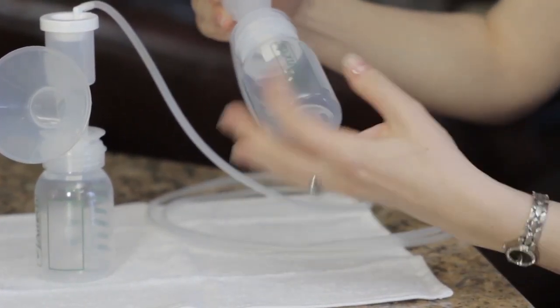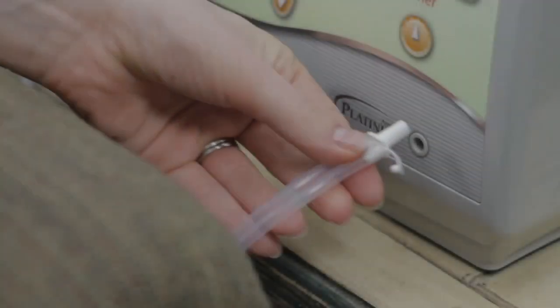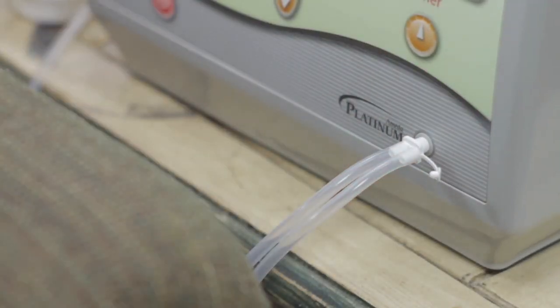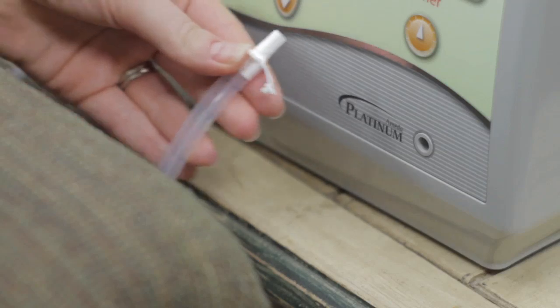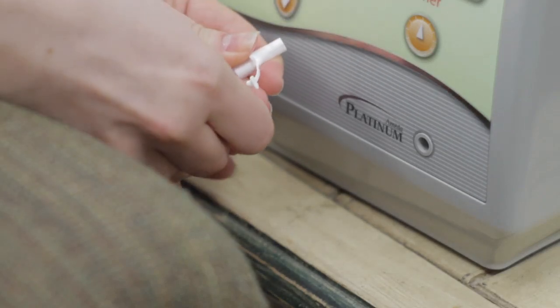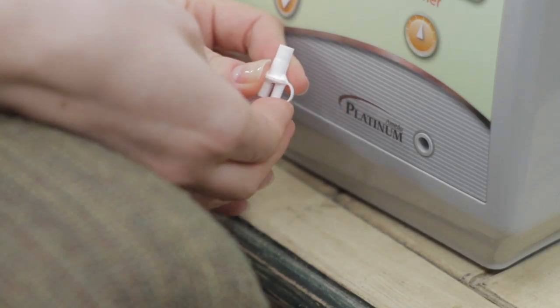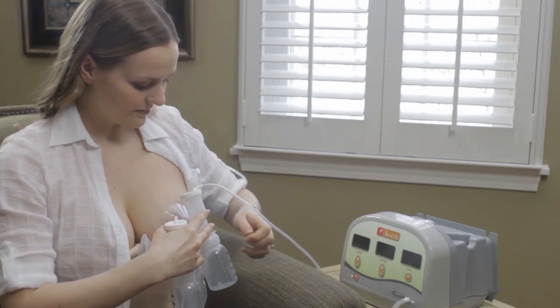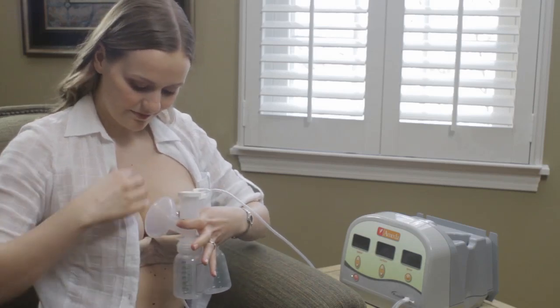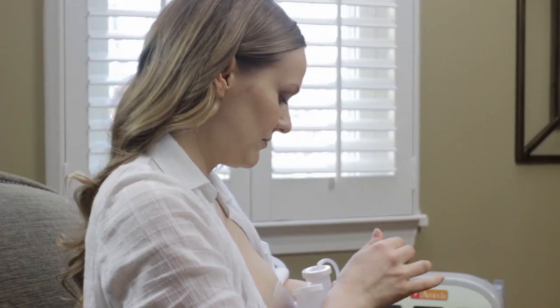Next, screw the collection bottle into place. And finally, push the tubing adapter, with tubing attached, into the tubing adapter port on the pump. The tubes from both collection kits should be plugged into the tubing adapter. If you are going to single pump, simply remove one tube and close it with the tab on the tubing adapter. When you hold the flanges to your breasts, make sure your nipples are centered in the nipple tunnel. Hold them firmly, but gently, to create an airtight seal around your breasts.